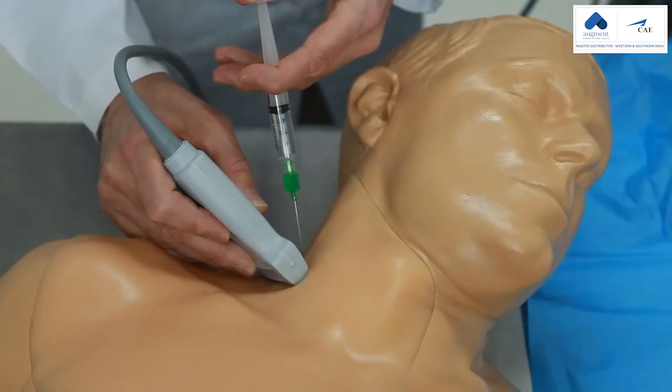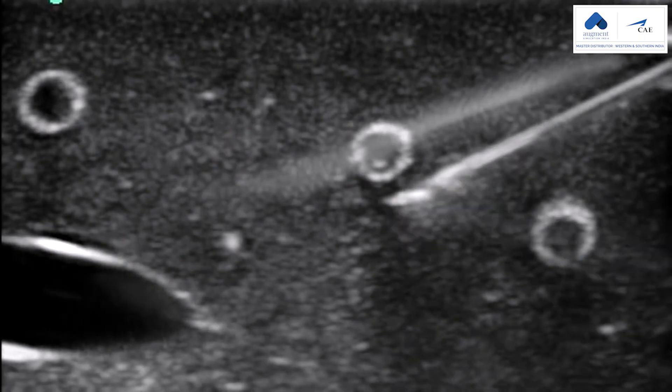For regional anesthesia training, we've added the supraclavicular nerve capability and more tissue area, allowing users to practice the posterior interscalene nerve block approach.